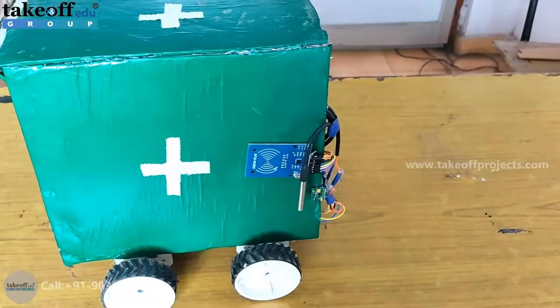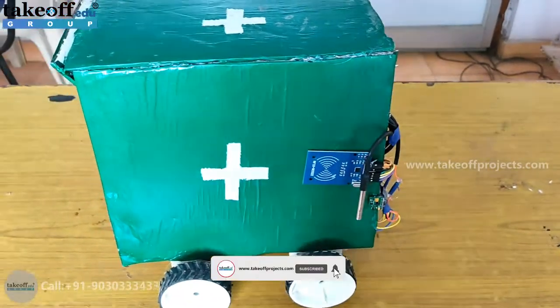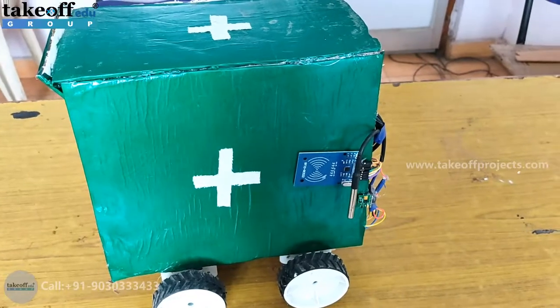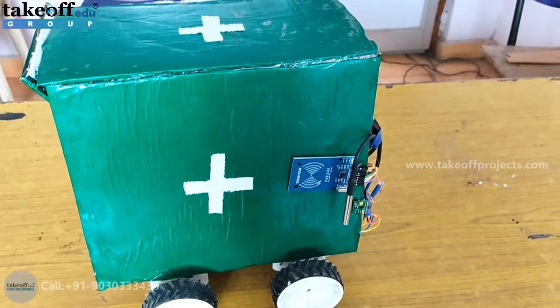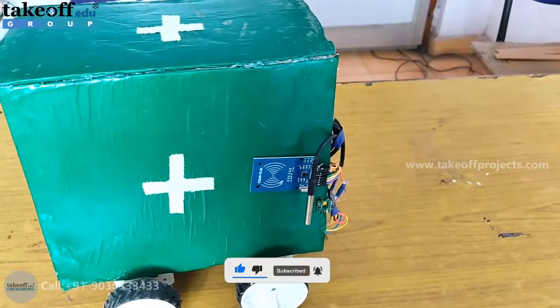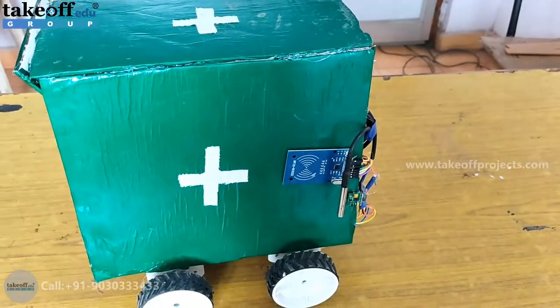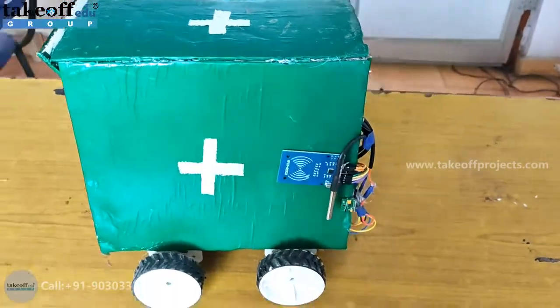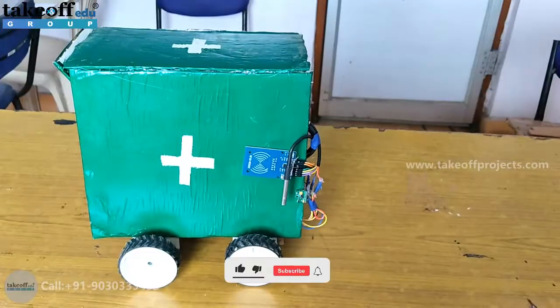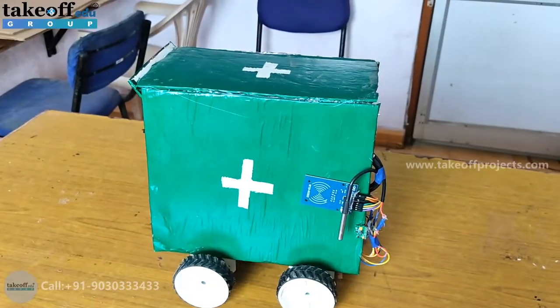of a patient and upload to a third-party server so that the doctor does not need to go to patients to check their heartbeat, temperature, and other things. The doctor can sit anywhere and see the health parameter values of all patients. This robot will also help supply medicines to the patients.